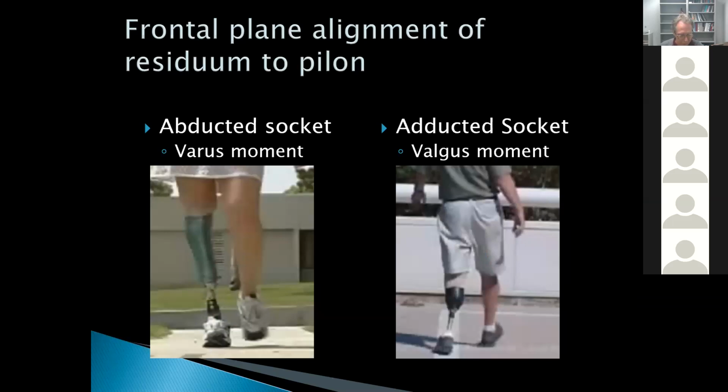Okay, so we were talking just a minute ago about the frontal plane loading, and what we want in frontal plane loading is what's called an abducted socket. Now this is something that you have to think about pretty carefully. I'll show you with these illustrations, and I'm going to show you with more of just some live stuff what that means.